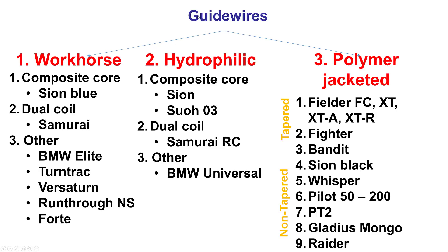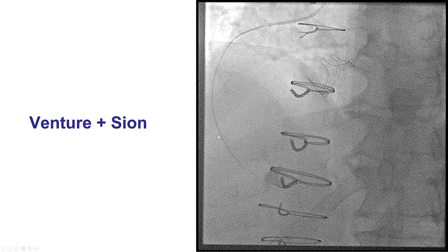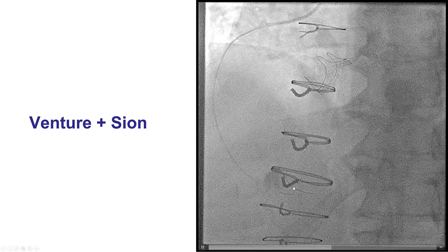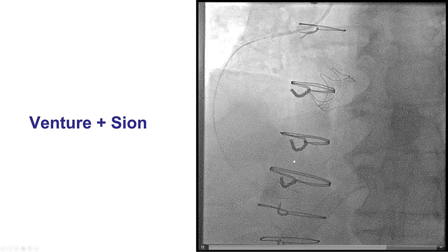Another trick for wiring through tortuosity is using a slippery wire. Instead of a workhorse, one can use a hydrophilic coating wire, or even more aggressively, a polymer-jacketed wire. In this case, we used a Sion composite core wire with hydrophilic coating all the way to the tip, in contrast to the Sion Blue which lacks hydrophilic coating at the distal tip. With the Venture catheter close to the tip providing strong support, the Sion wire was advanced further.